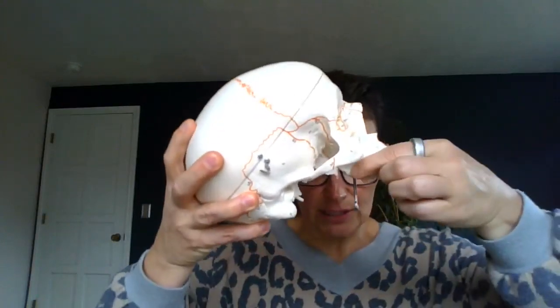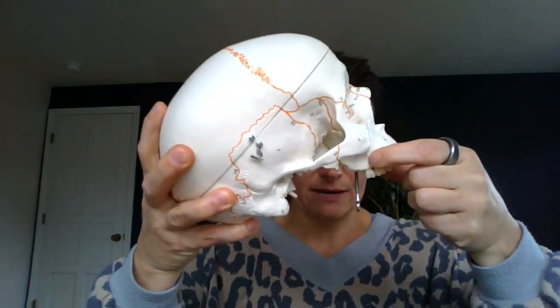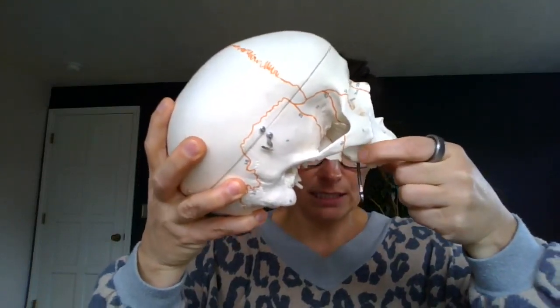The thing about the PSA injection is that it really is geometry in motion. We're trying to get all the way back up into this zone with our anesthetic, and we've got these things called cheeks that are in the way. We can't just go straight there — we have to do some modifications to our angulation to get to that zone right up above the maxillary tuberosity for that injection.